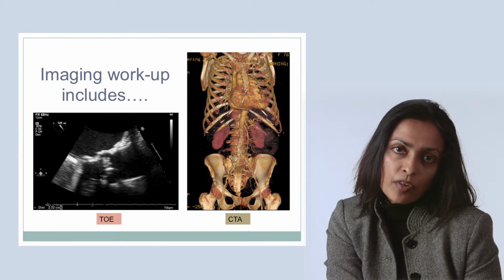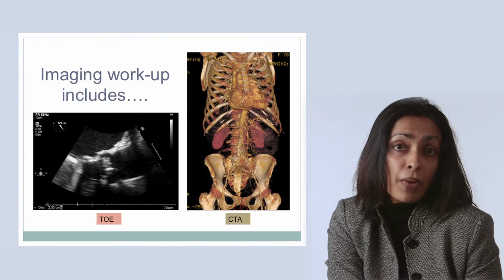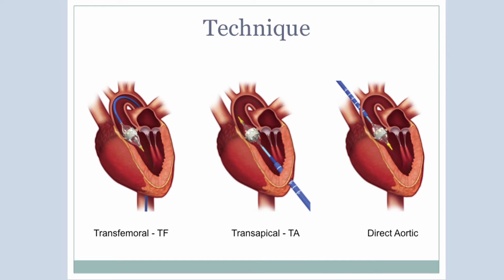CT assessment for evaluation of the femoral arteries allows the team to decide upon how best to deliver the new aortic valve. The preferred delivery route is the transfemoral approach because this is associated with the lowest rate of complications. The patient in our case underwent the direct aortic approach.